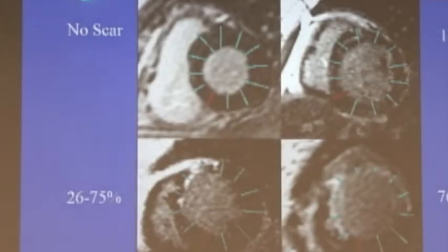There were a number of different scar patterns noted in these 26 patients. They all had documented no coronary disease in the cath. Some of the patients actually had no scar, and it was thought before this, and before some studies like this, that non-ischemic cardiomyopathy had very little scar. So we just wanted to see what was going on. A lot of the patients, in truth, had no scar, but some of them had this kind of mid-wall scar pattern, which actually had been noted in the distant past.